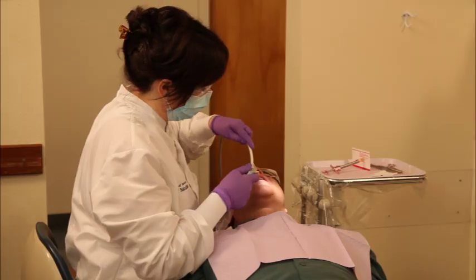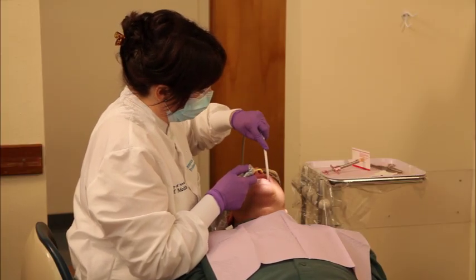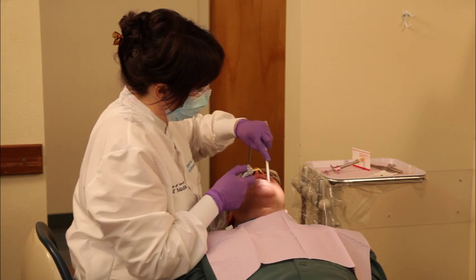Complications are rare with this injection, but can include some discomfort if the injection is too close to the periosteum. It is important to keep the needle parallel to the bone.